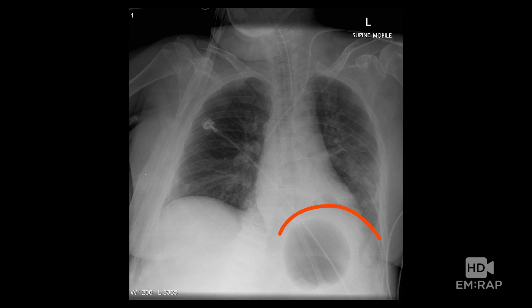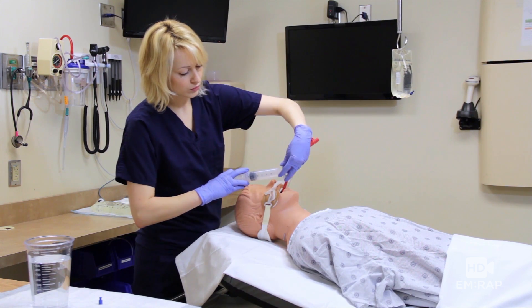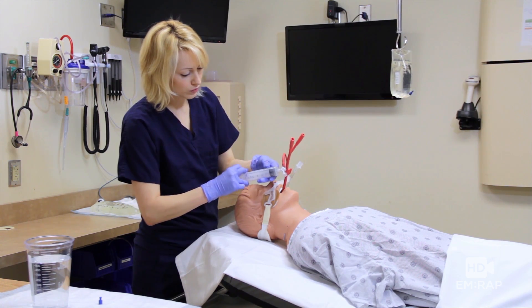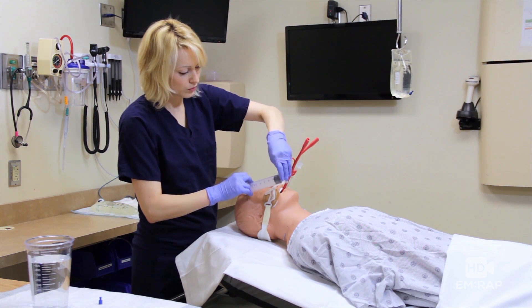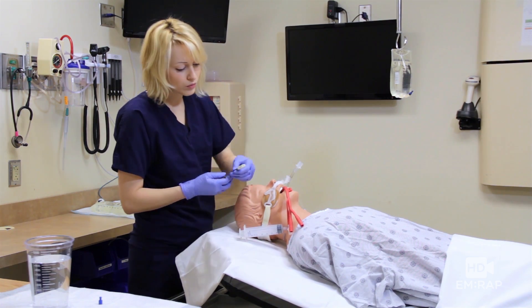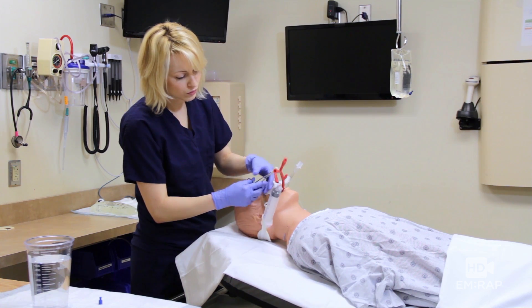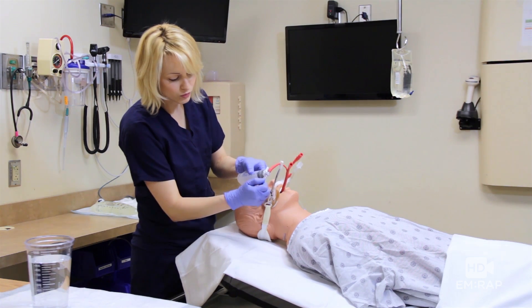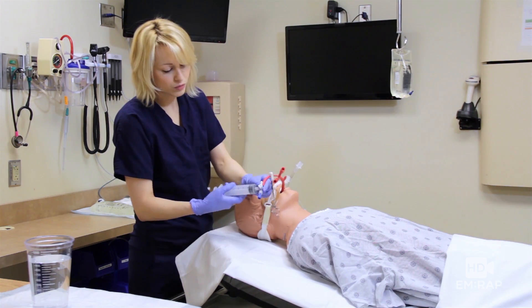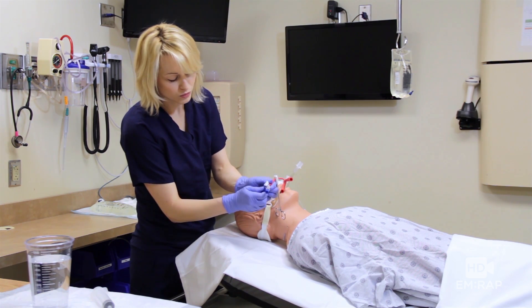If not, do not pass go, do not collect $200. Now we can safely inflate the balloon completely. The Linton tube takes 700 to 800cc's of air — that's a lot of air. It's 14 more pushes from your syringe. Count them out. Turn the stopcock to off and clamp it so it doesn't leak — double, triple sure. Replace the caps back on the three-way stopcock. Remove the syringe and put another cap on that port so it's locked, sealed, and no air is leaking out.